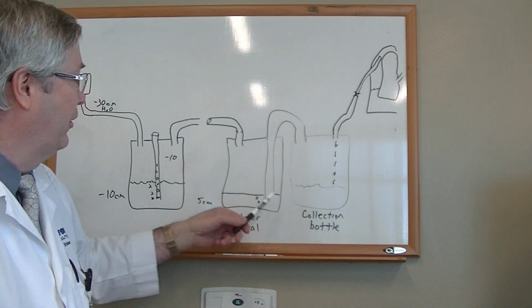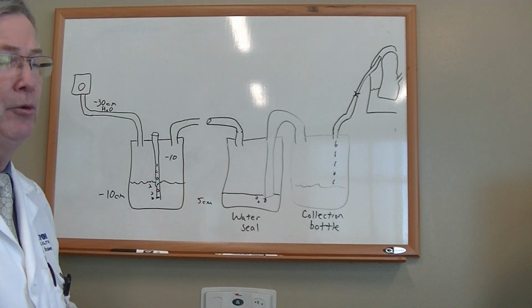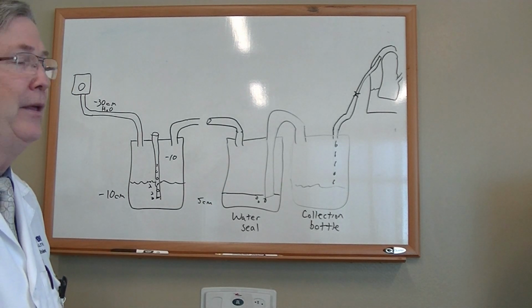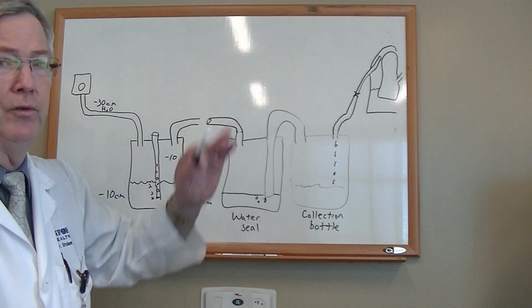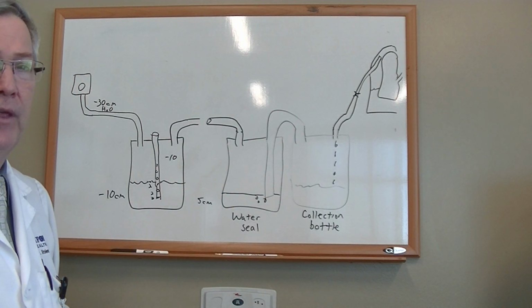If you unclamp it and all of a sudden there's bubbling, well, you can report that to the doctor and say, when I unclamped it, there was a lot of bubbling. That would tell you that there's probably still some pneumothorax in there, and we might end up putting it back to suction. And then if on the other hand, there's no bubbling and the x-ray shows the lung is up, we'll come take the chest tube out, and hopefully the care of that patient is complete.